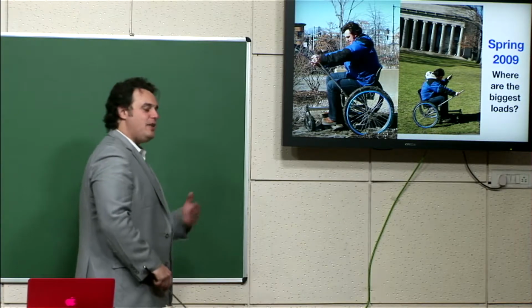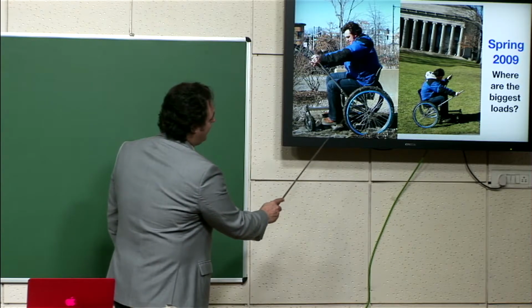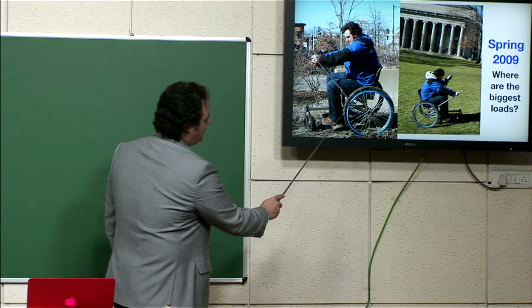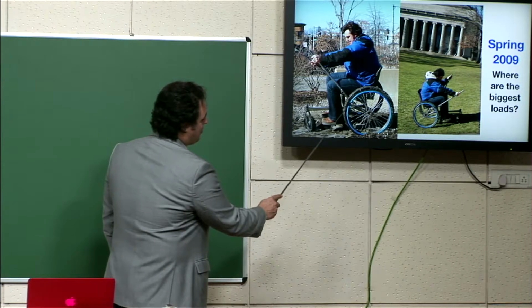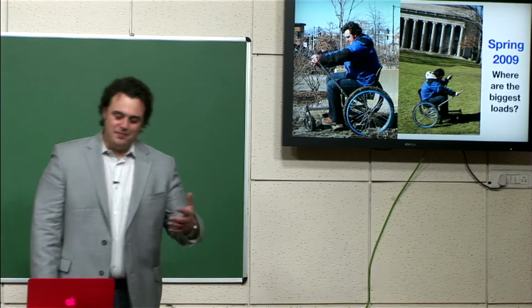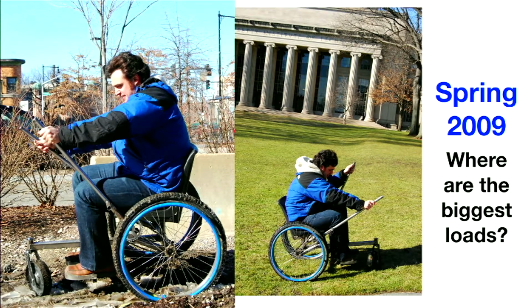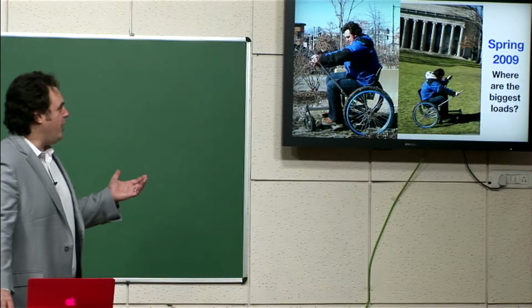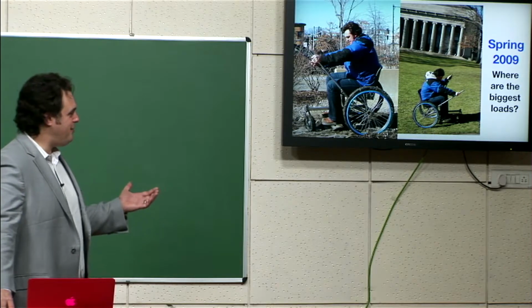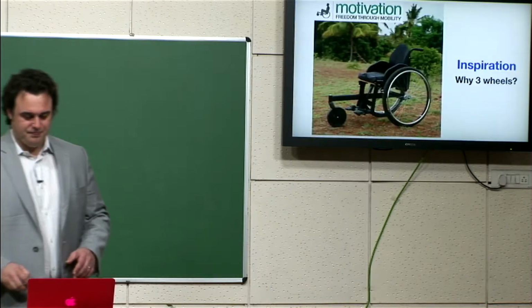So again, doing these bench level prototypes is helpful because we ended up putting this strut right here in the frame, which supports the axis of rotation of the chain ring and makes sure it doesn't bend backwards towards the wheel when a huge tension gets into the chain. So just a cool aside from a machine design standpoint. And we're not clairvoyant when it comes to this. We didn't realize this until the chain started falling off all the time and we were like, why does it keep falling off? And we realized, oh, we're flexing the frame because of the high loads of the chain.